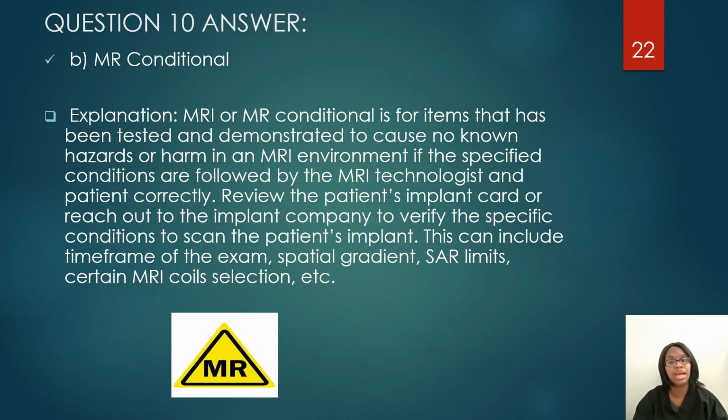Okay, I'm scanning their brain. Can I use a brain coil? Which brain coil can I use? So all of this stuff you have to know. You cannot just see this card and this symbol and say this patient is okay to scan.